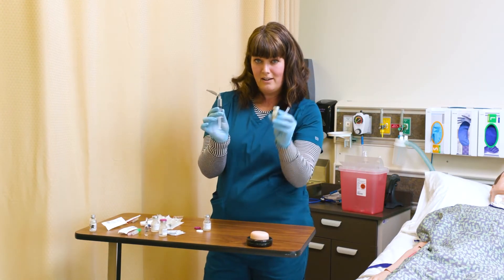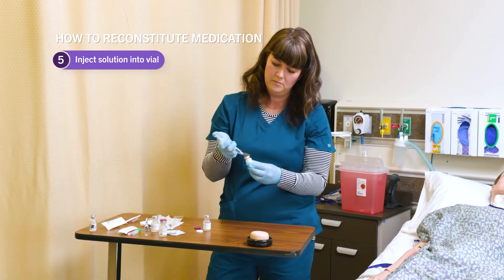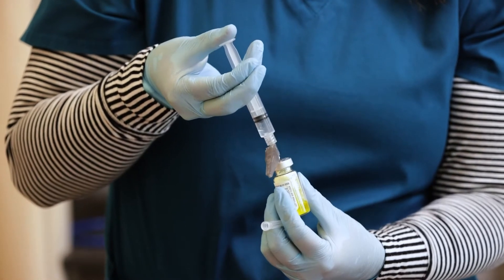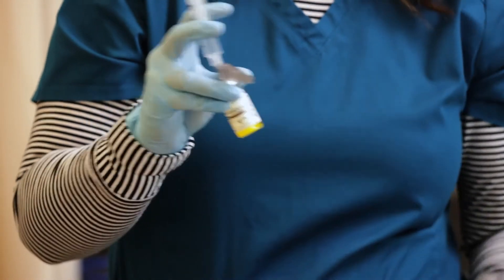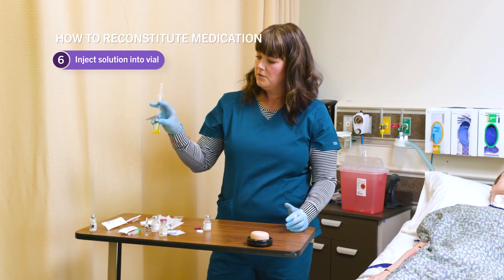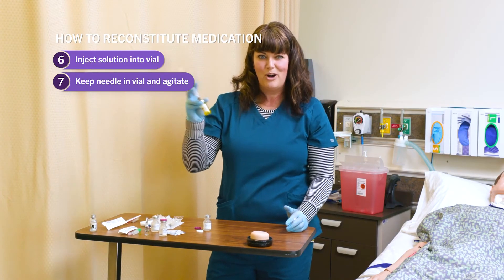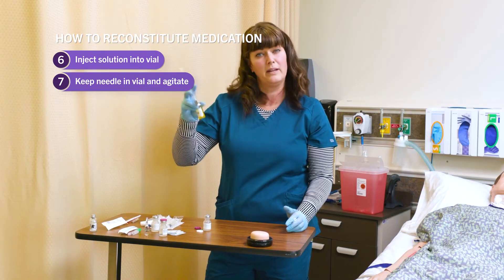I don't need to inject air into the powder vial because I'm injecting solution. Be patient with this — don't force the solution in. You'll feel pushback from the vial because of the pressure. I like to keep my needle in there because every time I take it out and re-access the vial, there's a possibility of contamination. Secure your vial with three fingers and your syringe with the others, and just agitate the solution. You're looking for all the little particles to break up and dissolve completely. It varies by medication — some are quick and some take a couple minutes.